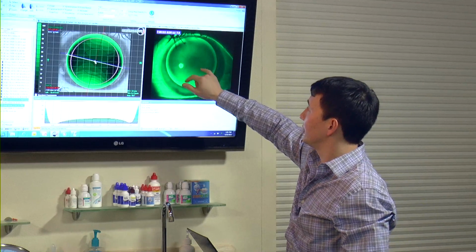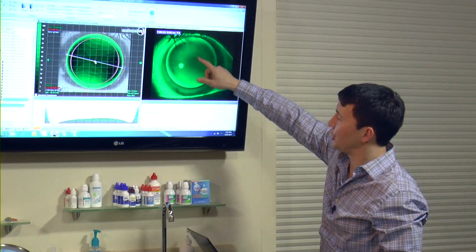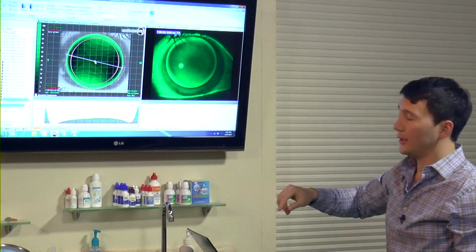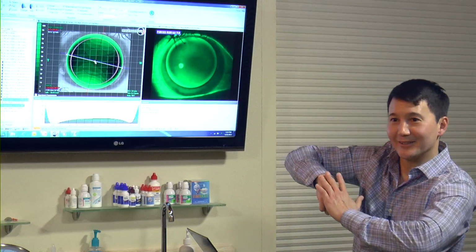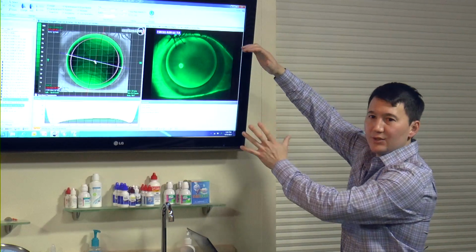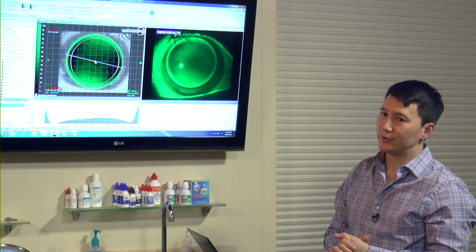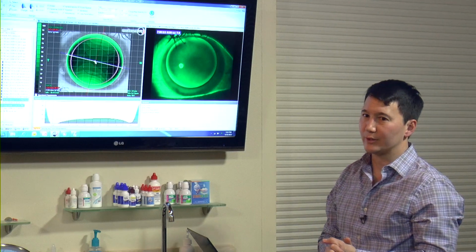Our lens is landing at 3 and 9 o'clock, which we predicted it would. Our lens has this fluid channel across the vertical meridian, and of course the problem is with that steep limbus-to-limbus meridian, the lens wants to decenter up, doesn't it? And this lens, if you saw it moving, moved excessively. Patient was very aware of it.